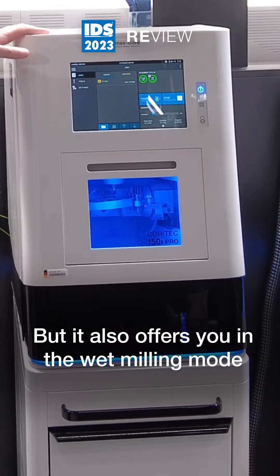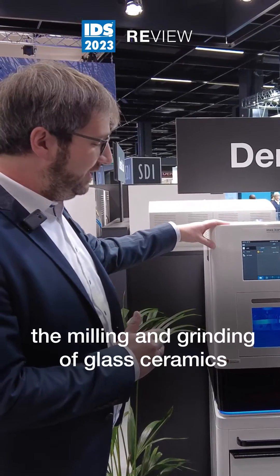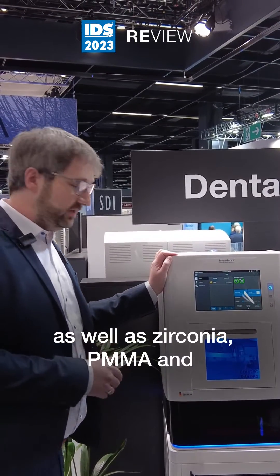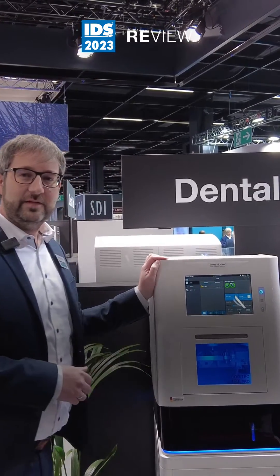It also offers you, in the wet milling mode, the milling and grinding of glass ceramics, as well as zirconia, PMMA, and pre-mill abutments.